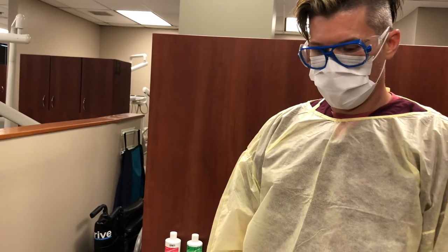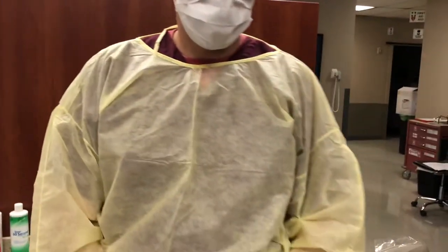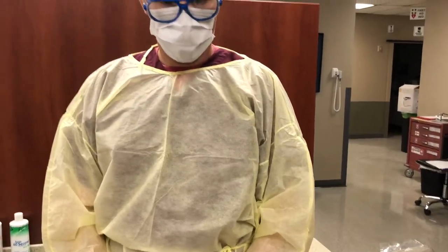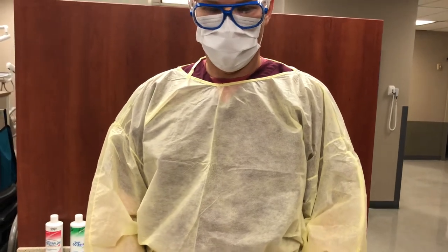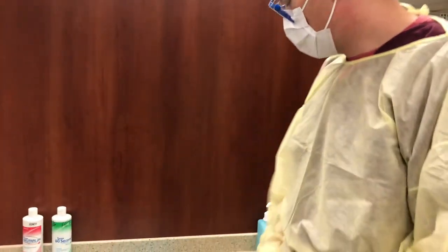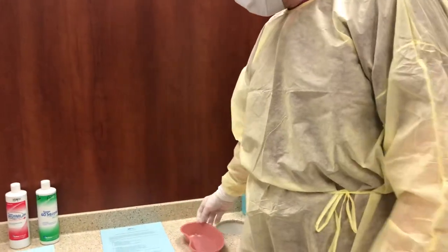You will first give the patient several paper towels and you will stay attentive to the patient and never leave the patient throughout the fluoride procedure. You will have already had an emesis basin placed on the countertop that is out for any type of fluoride procedure.